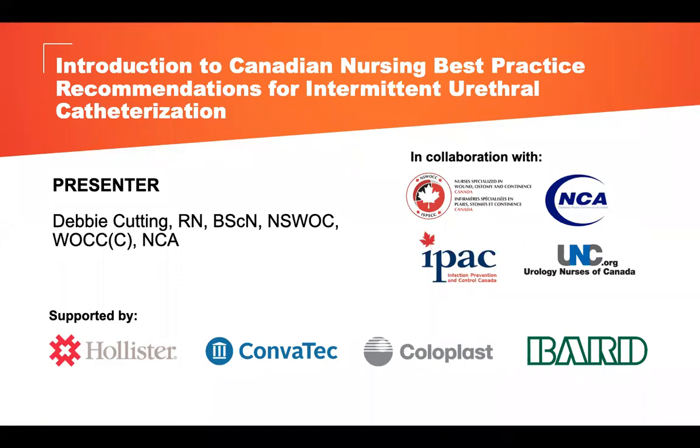Yeah. So the general recommendation is someone who's living with an indwelling catheter, we want to change it every 4 weeks. For whatever reason, if it had to stay in to 6 weeks, that would be a push. In those patients who are getting recurrent infections, I change them to changing it every 2 to 3 weeks. Obviously, if they have the resources, it could be changed weekly. So it's one of those things where you could reduce it by a week from 4 weeks to 3 weeks, see how it goes. If you still feel like they're getting a lot of infections, symptomatic, remember, not just bacteriuria, you could do it to every 2 weeks.